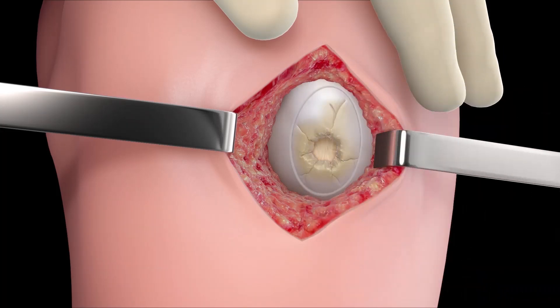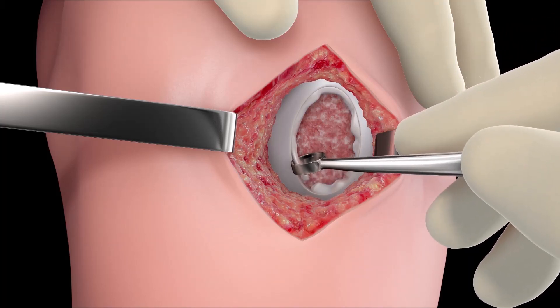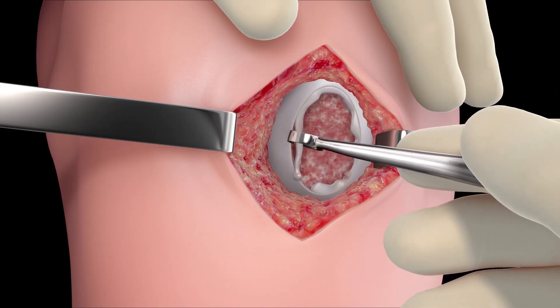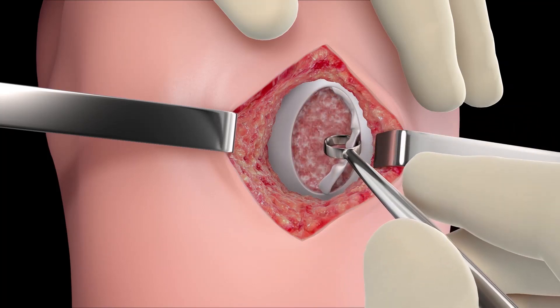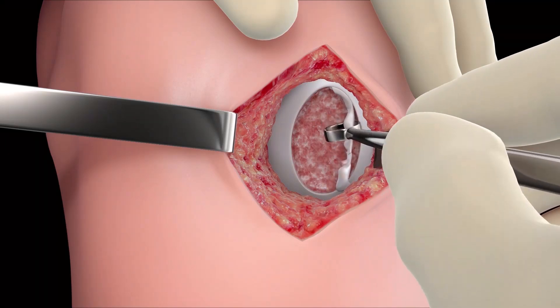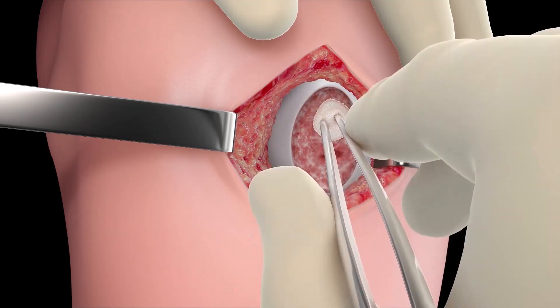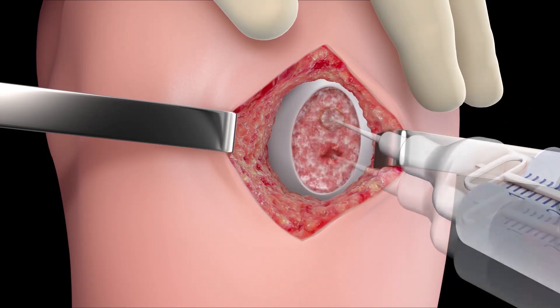Gently lift the instrument from the defect. Then, using a ring curette, remove all damaged and fibrous tissues, including the calcified layer from within the margins created by the instrument. Remove as little healthy cartilage as possible. If eburnated bone or osteophytes are present, they must be removed down to the level of the subchondral bone. For osteochondral defects, debride to healthy stable bone. Bleeding at the bone surface must be controlled using a hemostatic agent.